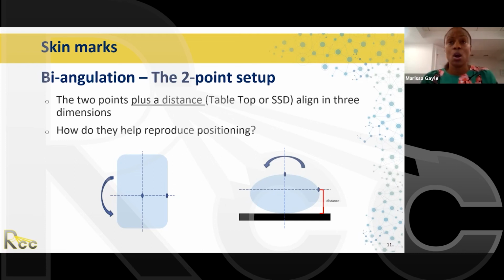During treatment, we tell the patients they should have a bowel movement before they come in. And for many of our prostate patients, we do a CBCT daily on them. So we will see if the rectum is full or not. And if it's full, we take you off the table. So about 75% of our patients will fall into that category.